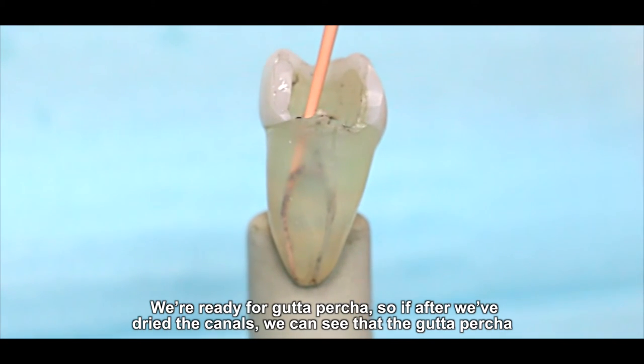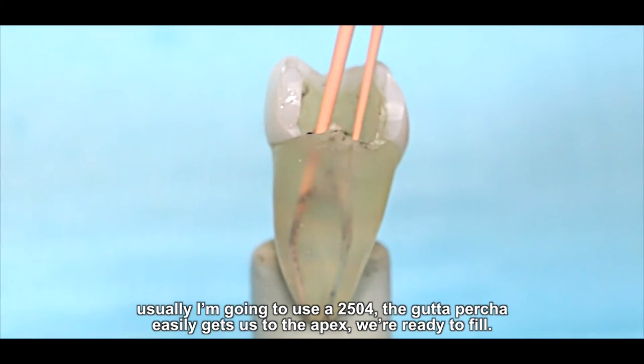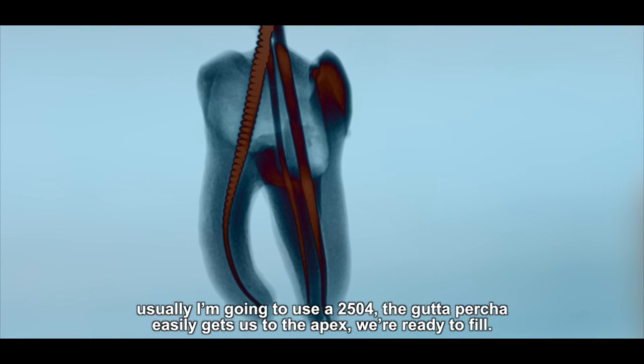After we've dried the canals, we can see the gutta percha — I'm going to use a 25/04. The gutta percha easily gets to the apex. We're ready to fill.